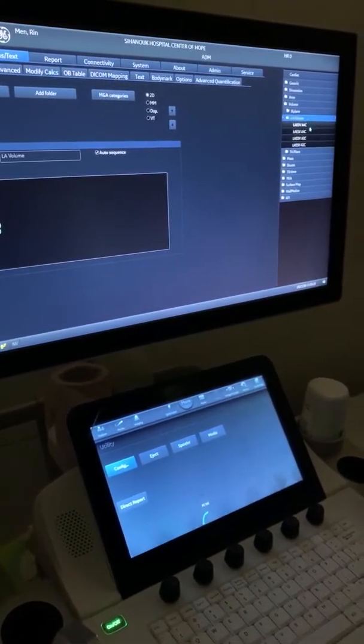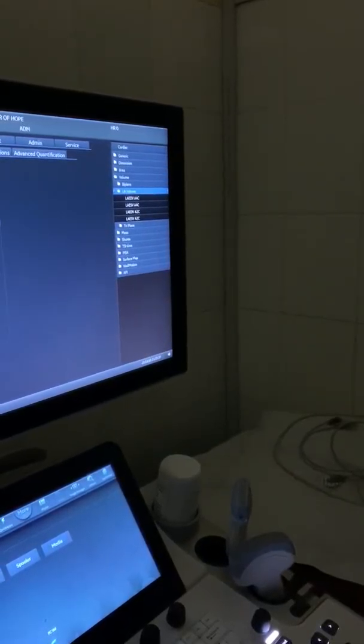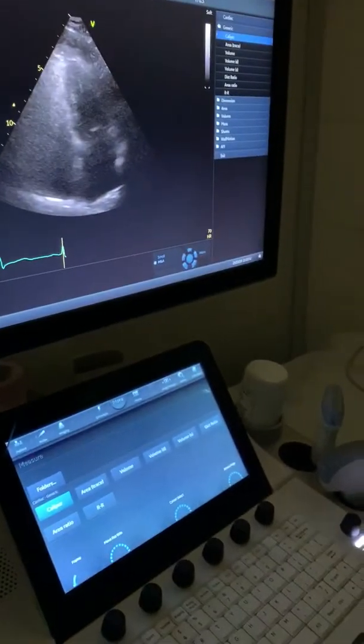But here it tells you you need 4 chamber, diastole and systole. If you want the 2 chamber, it's also possible. So what do we do? We remove the 2 chamber, so we use only the 4 chamber. I don't need the modified one, because modified is like 2-chamber. From here I go up. You can start measuring now, doctor.